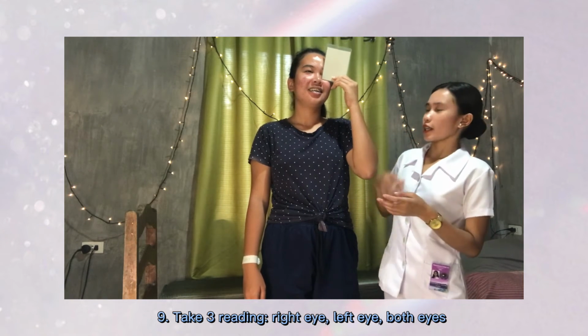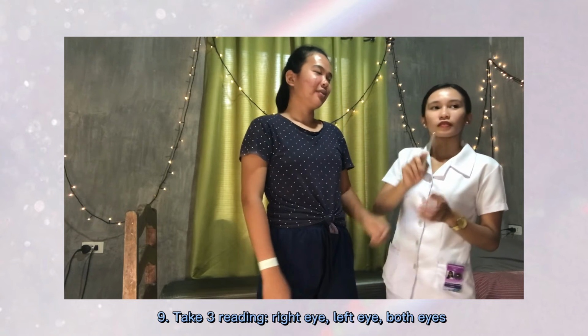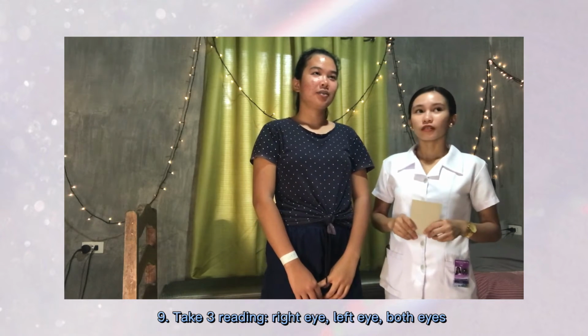Okay, Mom, and uncover both your eyes. Please read the Snellen chart.